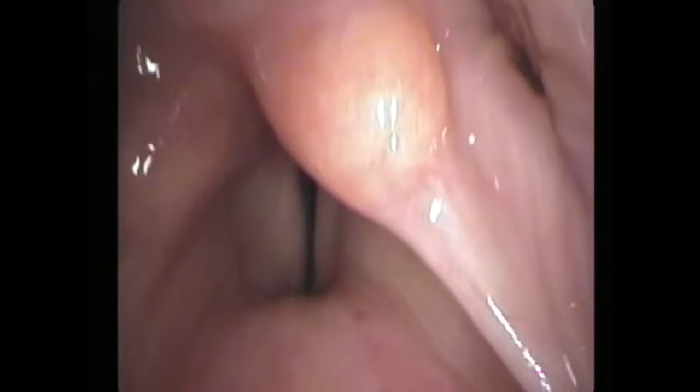But then, with a deep breath in, we see a twitch on the right side. And it's very helpful to slow this down to see the timing of the twitch, and what direction the vocal process moves on the right side as the left side is opening. A sniff provides maximal stimulus. So when you elicit a sniff in a patient, we should see the vocal process move to its most abducted position.